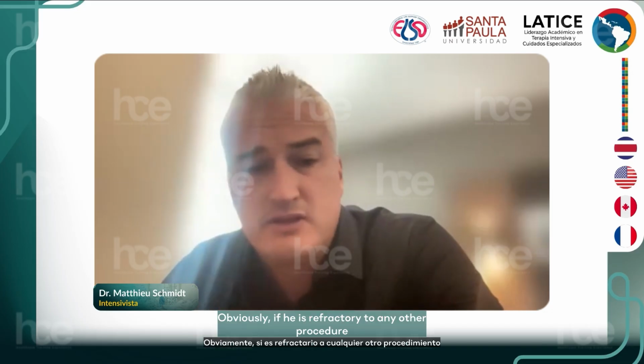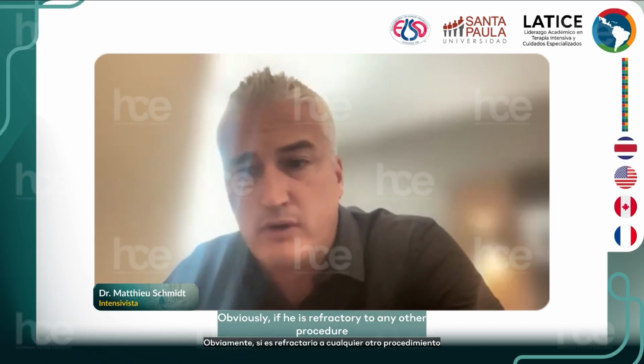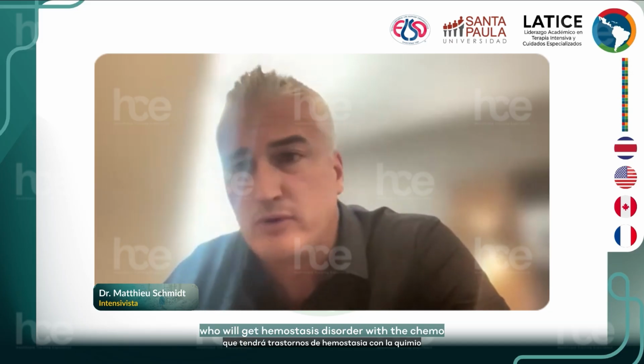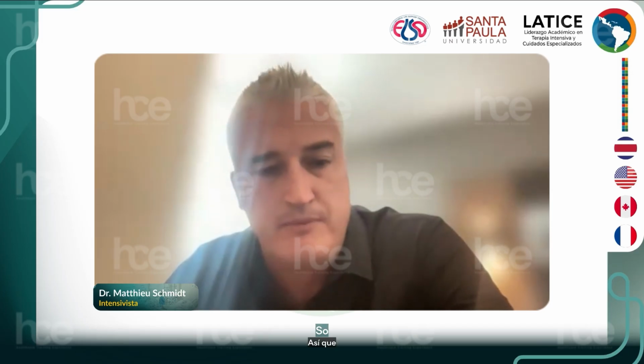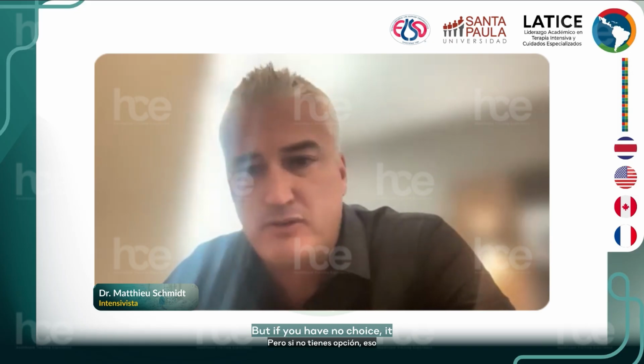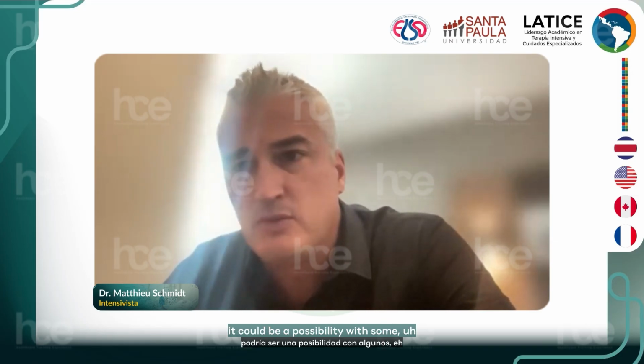Obviously, if they are refractory to any other procedure, because it's always challenging to put VV ECMO in a patient who will get a hemostasis disorder with chemo and low platelet count and so on. So if we can avoid using ECMO in this context, it's always better. But if you have no choice, it could be a possibility, with some successful cases in recent years.